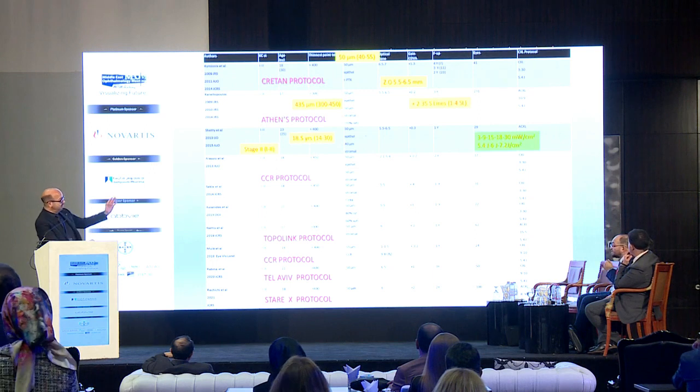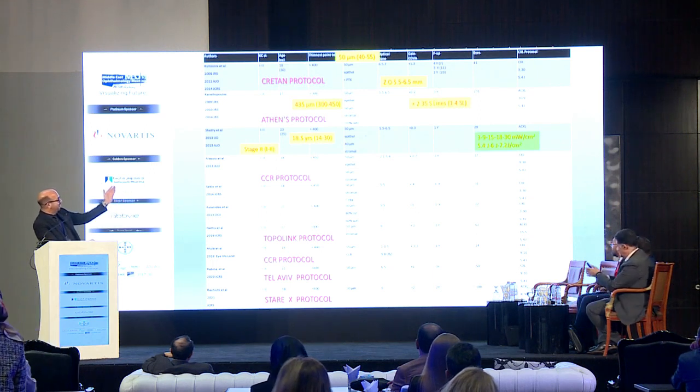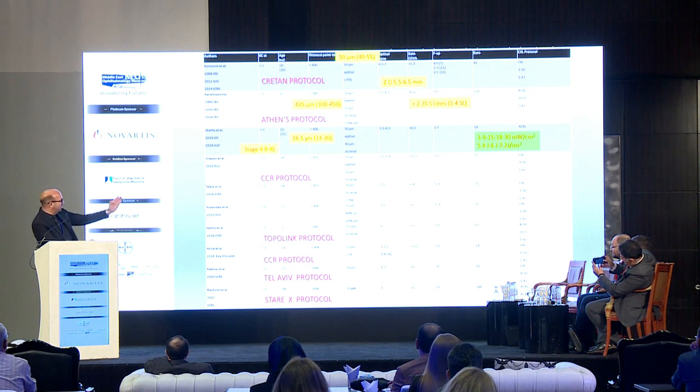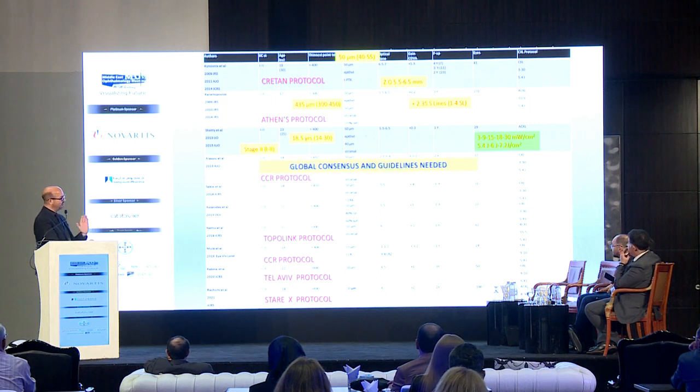But actually that's what the study was saying. Take a look to this. We have a gain of average 2.3 lines, but take a look to the cross-linking protocols, each different. So we need a global consensus and guidelines, okay?